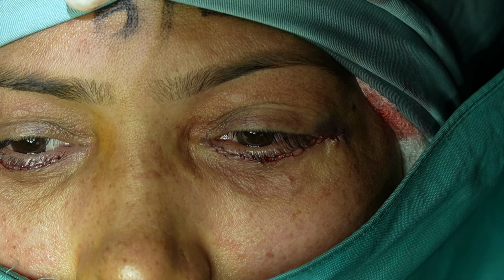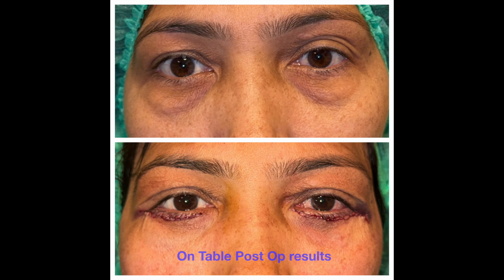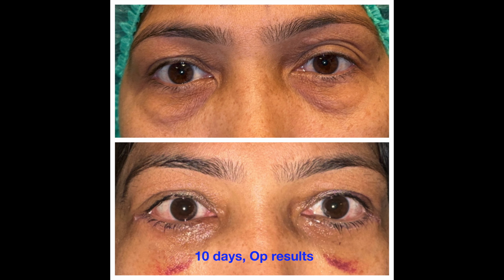Final inspection confirms a good contour of the lower eyelid and with preservation of natural anatomy.